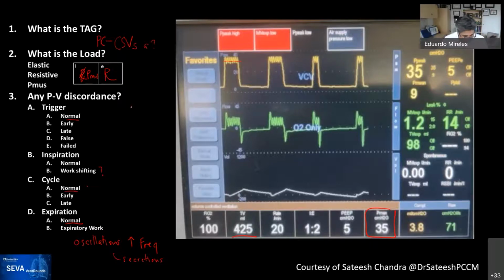I don't recognize the ventilator. I think somebody made it in their basement. Yeah, no, it says Engstrom. It is an Engstrom. Thank you, Satish. Engstrom is no longer marketed. That's a very old brand name of ventilator. It was what GE used to be. God only knows how old this ventilator is, but Engstrom is no longer marketed in the United States.